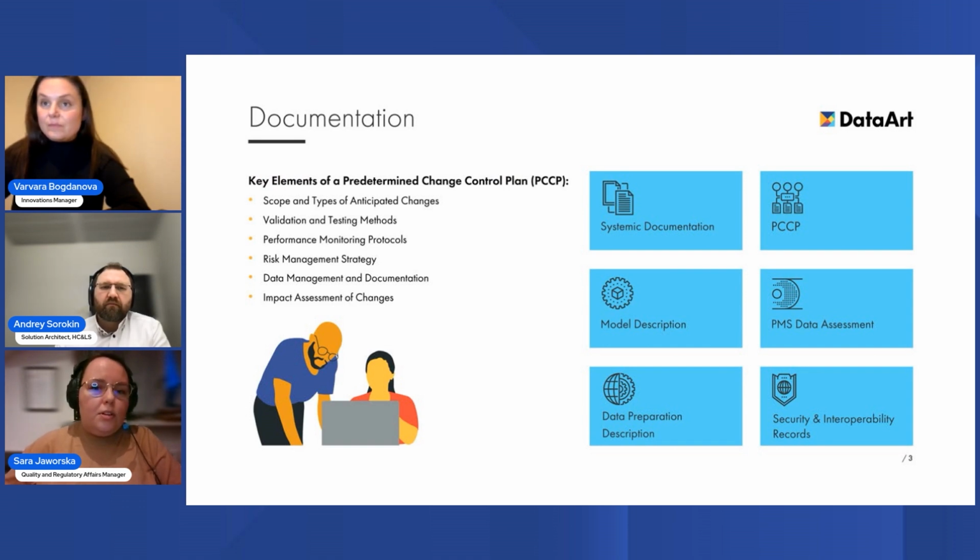Well, as always, when talking about medical devices, we need to consider two aspects. The first one is product requirements, and the second one is systemic requirements. And when talking about the product, there is a bunch of documents to generate. The starting point should be drafting the intended use of the medical device. That will define what needs to be validated, how reliable the model must be, and in what clinical context it will be applied. Once this is clear, companies can structure their verification, validation, and risk management plans.